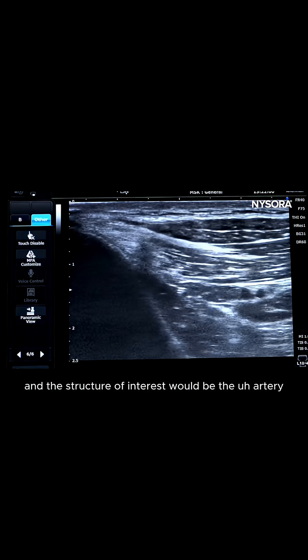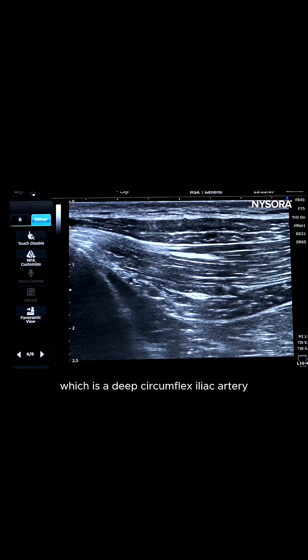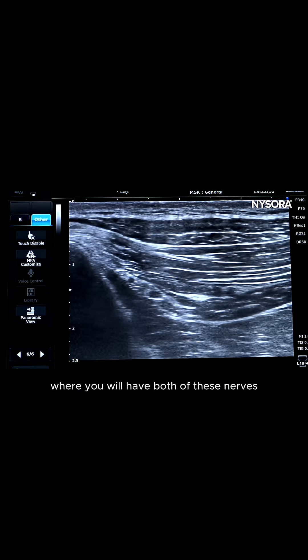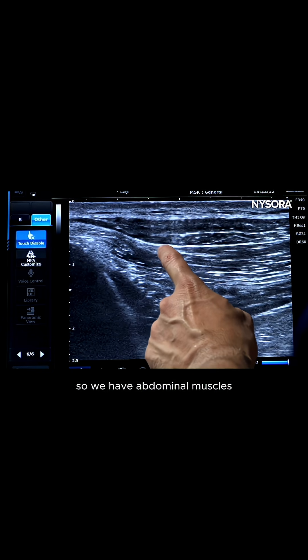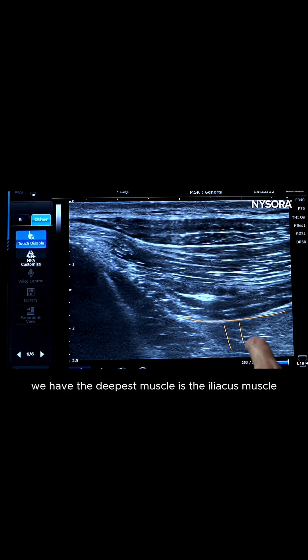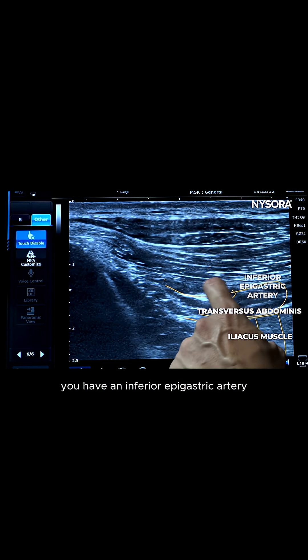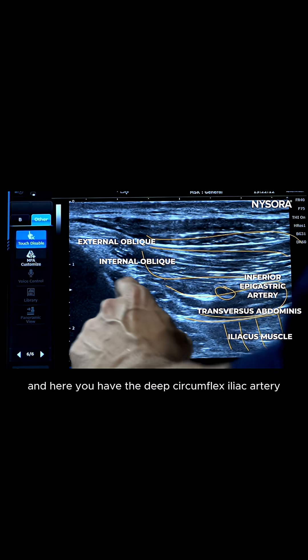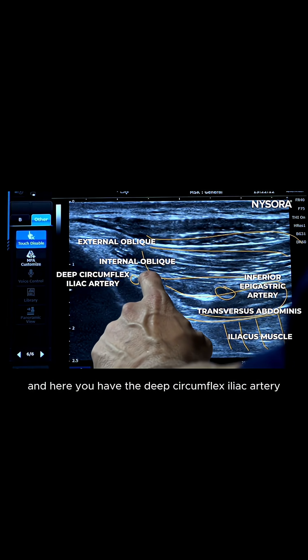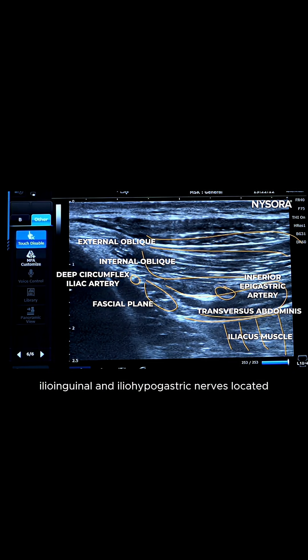The structure of interest is the deep circumflex iliac artery, along with the fascial plane where both nerves are located, as shown on this picture. We have the abdominal muscles: the deepest is the iliacus muscle, then the transverse abdominis muscle, the inferior epigastric artery, the internal oblique muscle, and the external oblique muscle. Here you have the deep circumflex iliac artery along with the fascial plane where both the ilioinguinal and iliohypogastric nerves are located.